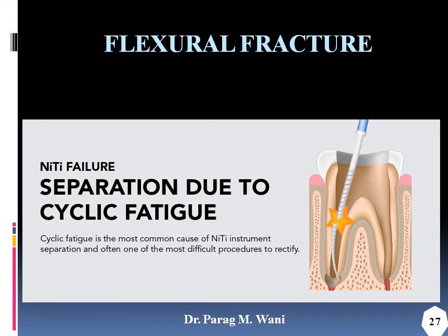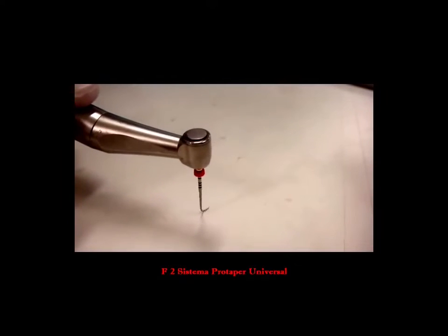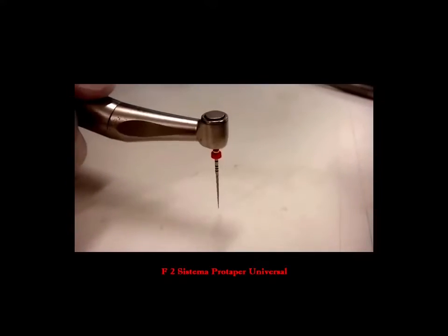The second and most common way by which the file fractures is cyclic fatigue, where the file is tired or there are too many microfractures present and we are still overusing it. It's the typical abuse or overuse of the file that we do. As you can see in this video, after a particular point the file cannot take the stresses on the curvature or on the bend, and that is the point where it fractures.